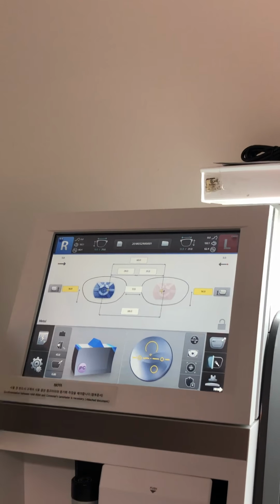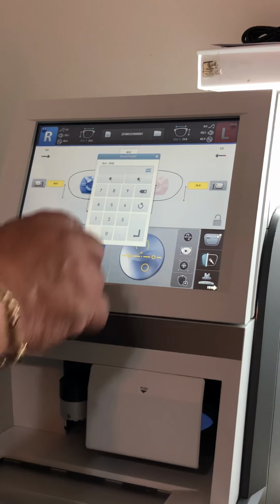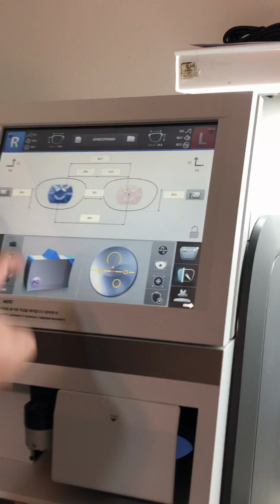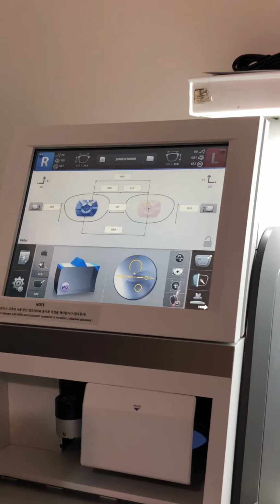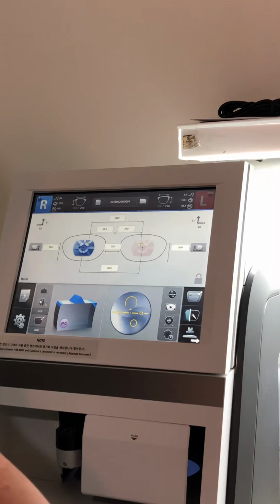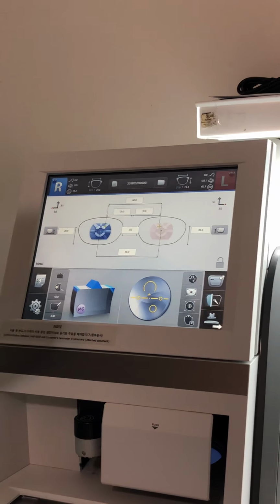Okay? Whatever our heights are, it's written on your prescription. You go right here and you set it for whatever you want. Okay? What's that, 20? Yeah, I put it in 20. Or is there a number you like better? No, whichever one. What I'm just saying is, whatever's written on your paperwork. No, that's your height.